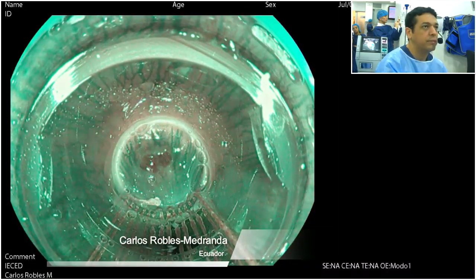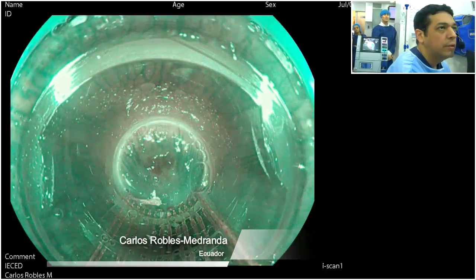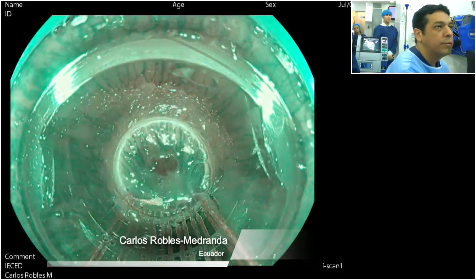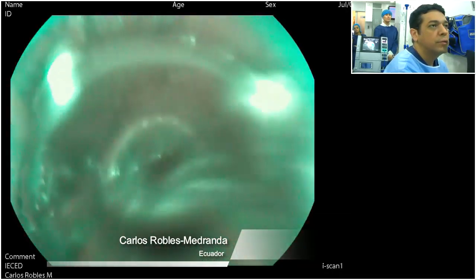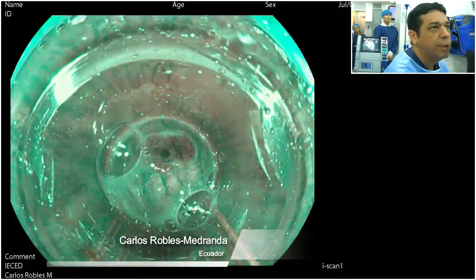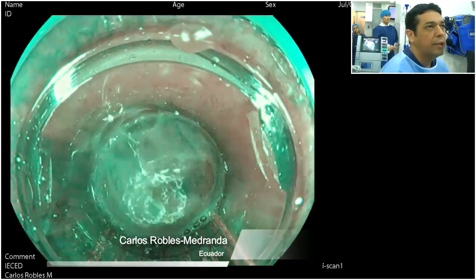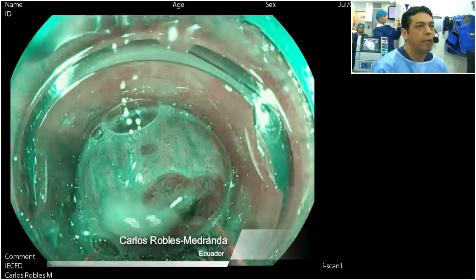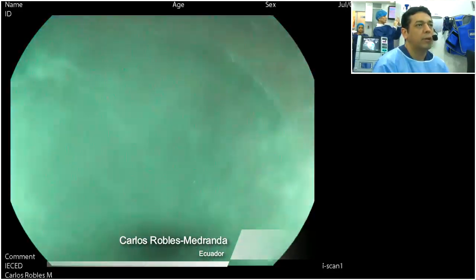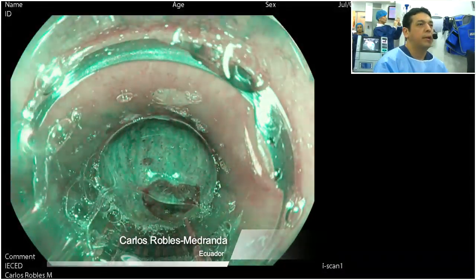I will fix now. And I will start to perform my aspiration, trying to keep my lesion in the middle. You see here, it is under control the whole time. And now I will apply a band.